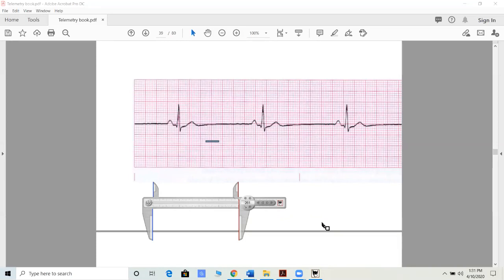Normally when we sleep, our heart rates don't usually go down to 38. I mean, it could be an amazing athlete, and that might even be normal while they sleep. I'm not saying it's not, because we've got a P wave, we've got a QRS, we can do the measurements. But if you have someone on a telemetry monitor in a bed and you're seeing this, this is not normal. If this starts dropping, they are going to become hypoxic.